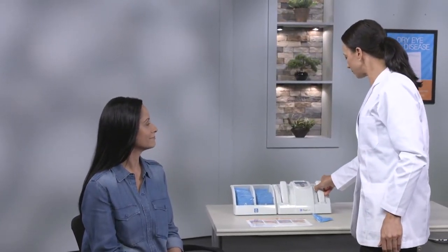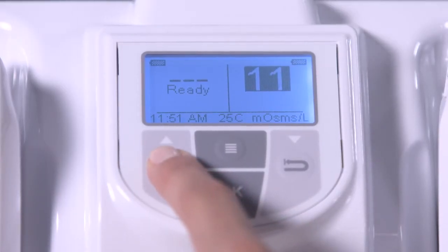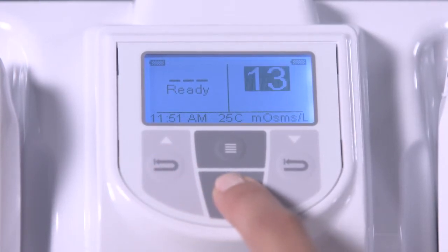Successful tear collection will be indicated by the beep of the pen and the green light going off. Dock the pen into the TearLab within 40 seconds and note the numeric code on top of the test card. Enter the numeric code by pressing the recall buttons below the up and down arrow keys on the TearLab. You have 8 seconds to match the codes. Press OK to accept the code.